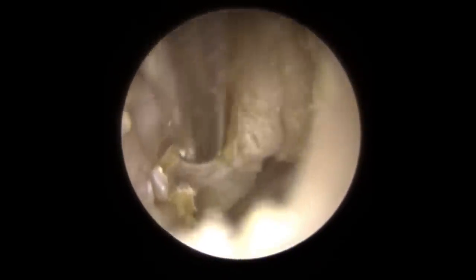Just trying to pull down from the top — you can see it starting to peel away from the skin underneath. There — see that coming away? Now we've loosened it; it's come away from the drum. You can see it's loose, moving back and forth — see how thick that is. But it's still held to the bottom left and top right of the canal. One continuous piece. So I'm going to aim for the center section, try and hold it and pull — but it's not coming away, so let's try and strip away one corner.